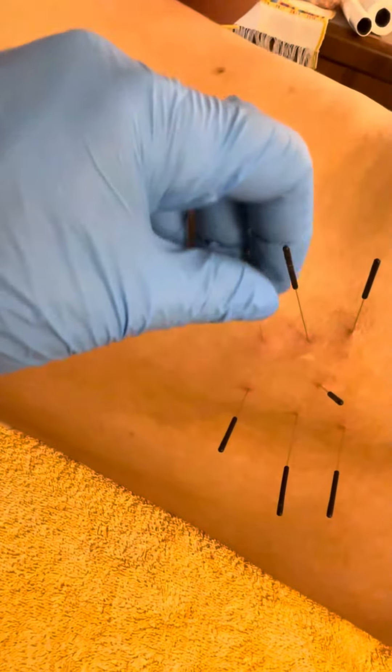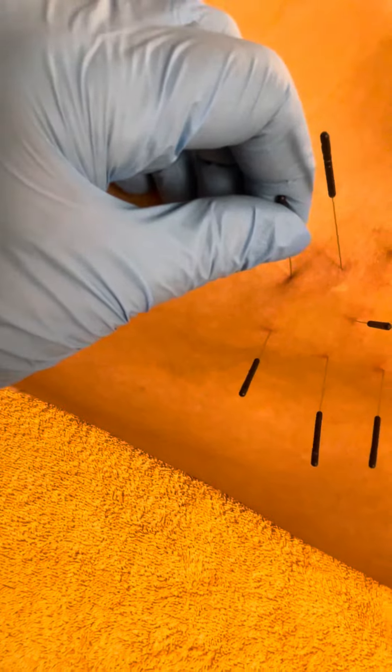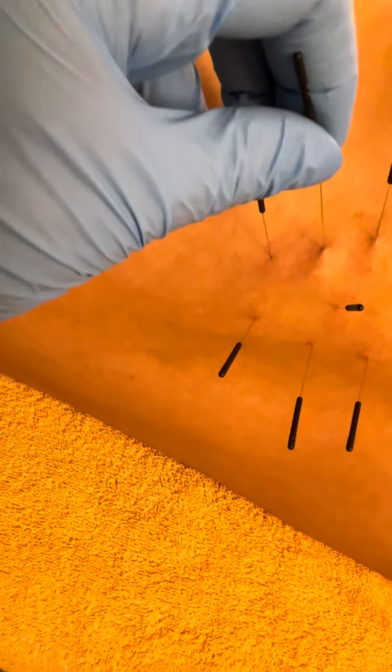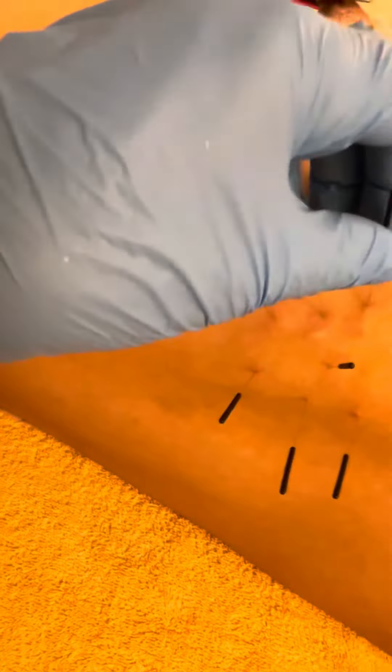Stop me if anything is too much. I'm going to stimulate this one. Is that okay? Nice deep breath. You okay? Number two. You okay? Number three.